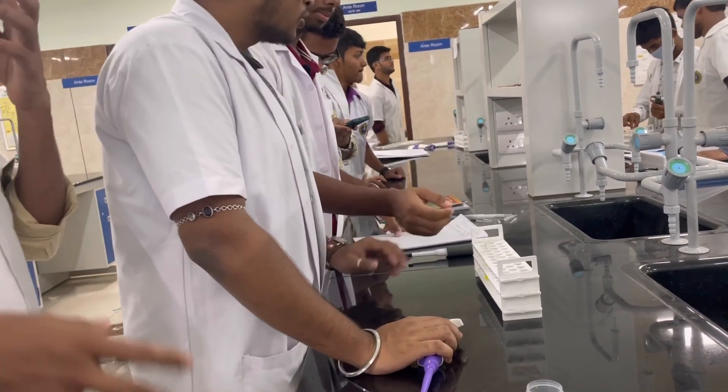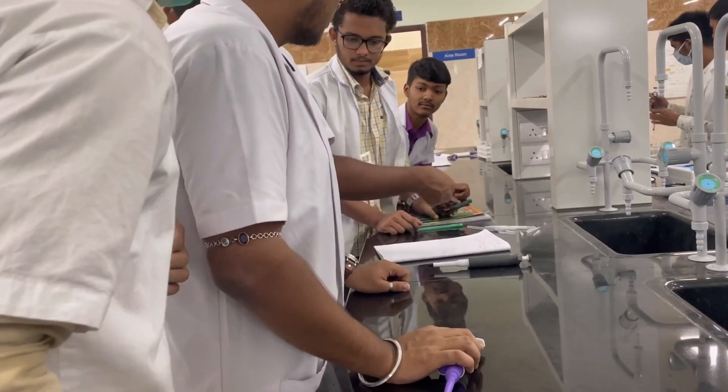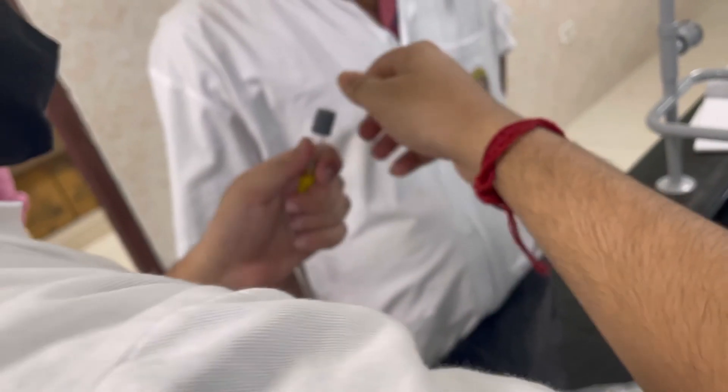It is then kept inside a centrifugation machine and centrifuged at 3000 RPM for 10 minutes.